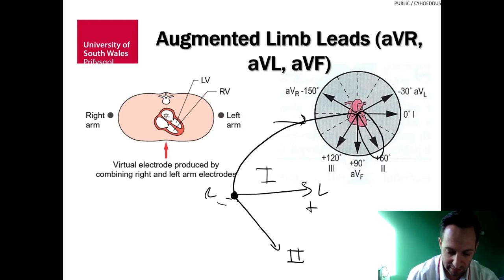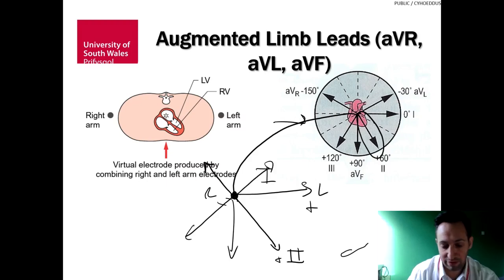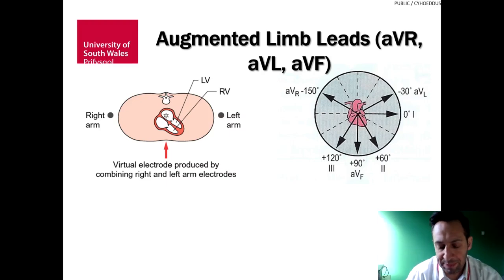Okay, with its negative and positive. So I'm just bringing all of the negatives together. Lead 3, therefore, comes in like this, and then they've actually taken the trouble to put on AVR, AVL, and AVF. This is called the hexaxial diagram, or the Cabrera diagram, named after the Portuguese physician Cabrera who first did it. Okay, hexaxial diagram.